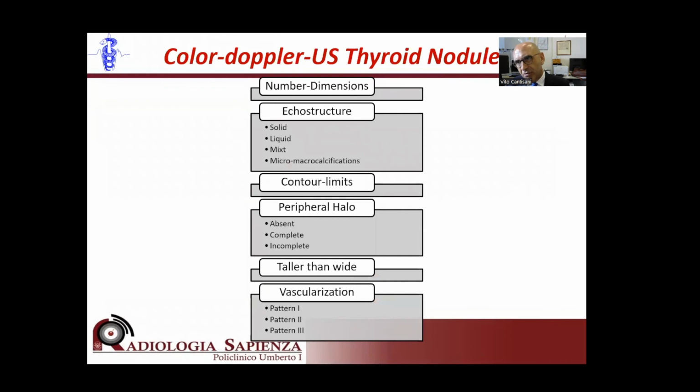And I will try to address this issue starting from what we usually do in the daily practice. We start with baseline ultrasound.